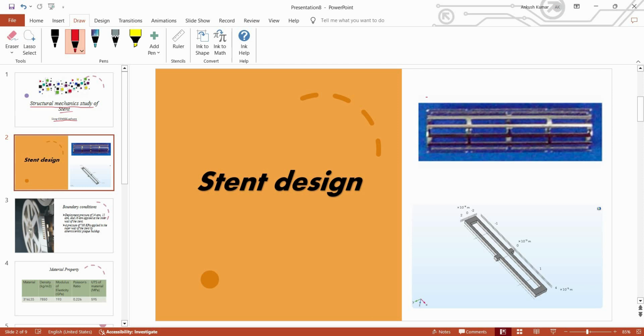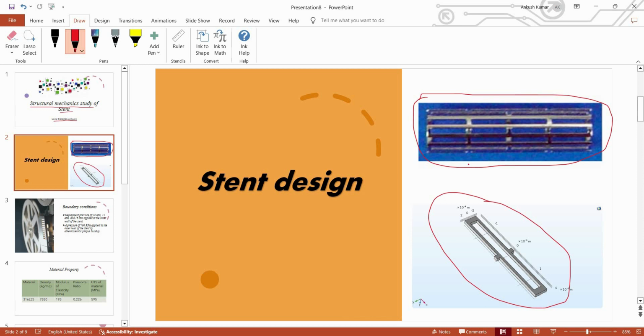So this is the Stent, which is the standard design. And what we are doing is just taking a single part of the Stent to perform structural mechanics in COMSOL software. So we have just taken this single part from this area, as you can see in this image.